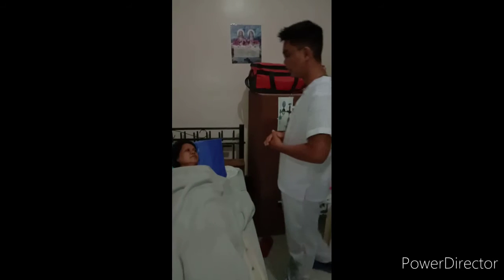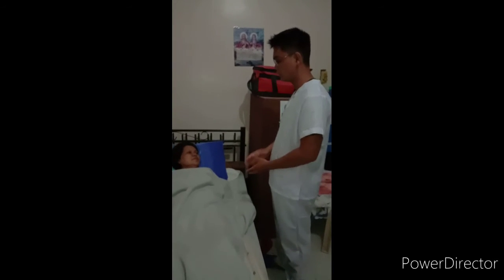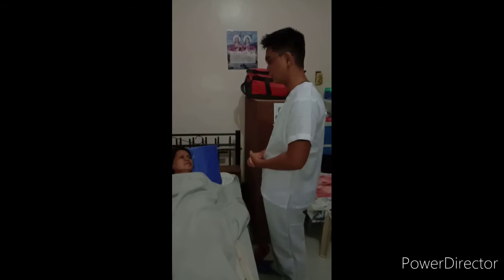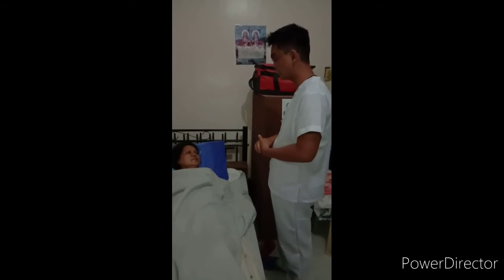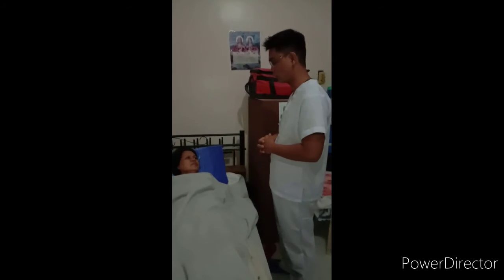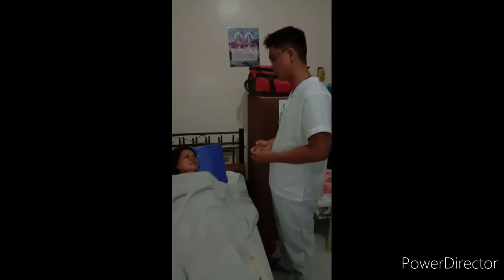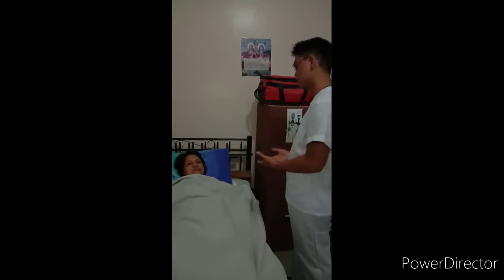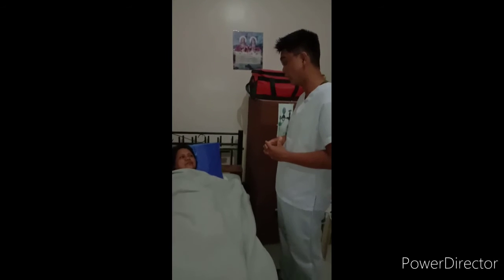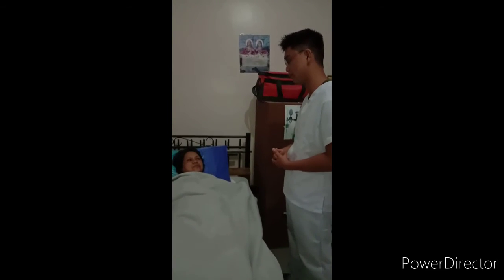Good day, ma'am. My name is Joseb Rosas, I'm your nurse today. Today, I will administer oxygen via nasal cannula and simple oxygen mask. This procedure — oxygen therapy — is used to relieve symptoms of hypoxia or hypoxemia.